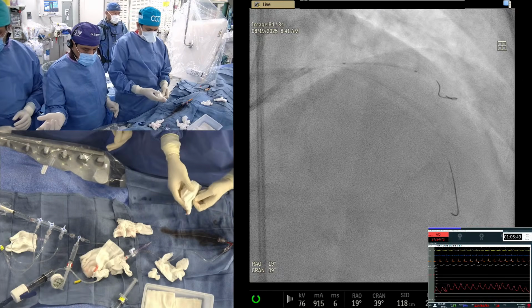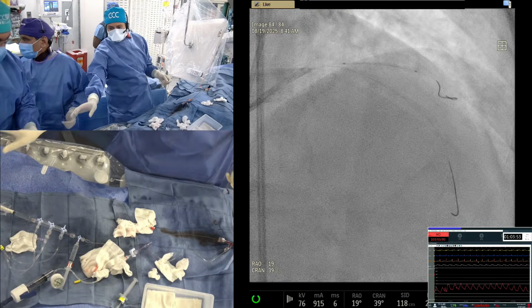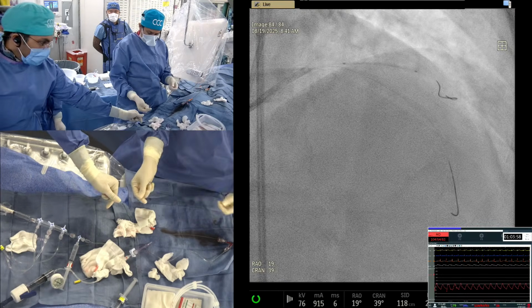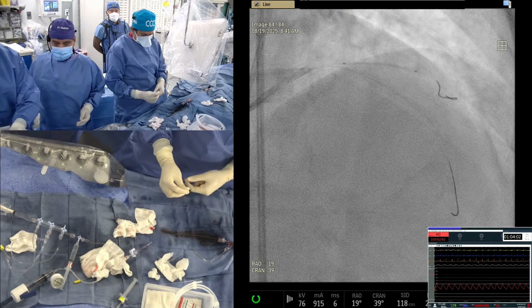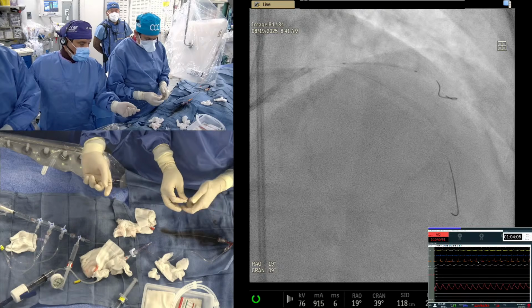Can we show the mini crush? Is the left main there? Mini crush? Felipe? No, but he is there. Andrew is there now. Okay. Samin, is Orsiro made by Boston Scientific now? No, it's a different company.